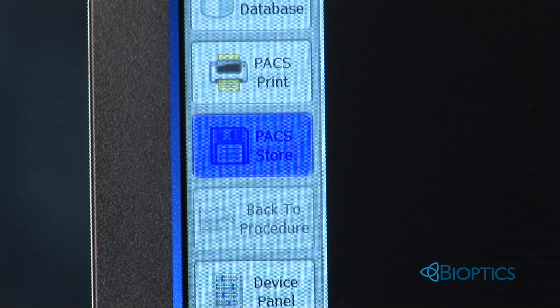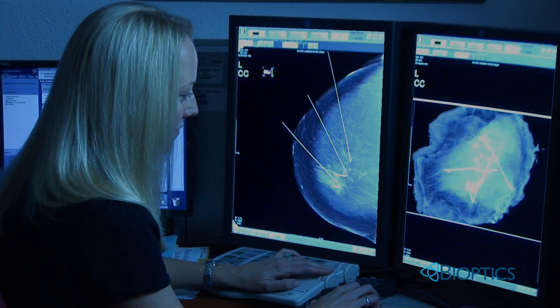In addition, you can now send the image to the PACS for a simultaneous review with the radiologist.